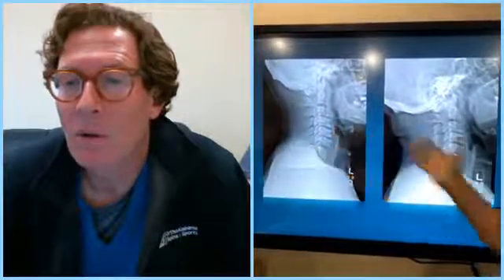So this is a picture of a patient before surgery. Same patient after surgery, completely rebuilt, has been able to resume completely normal activities with a 6-level neck decompression, as opposed to a neck that won't move again.